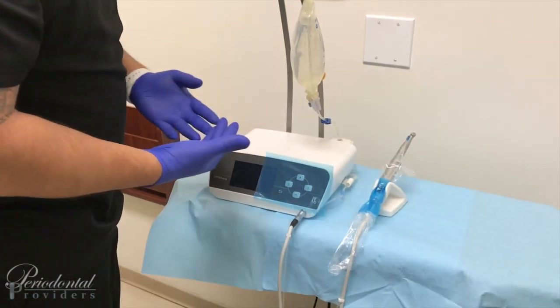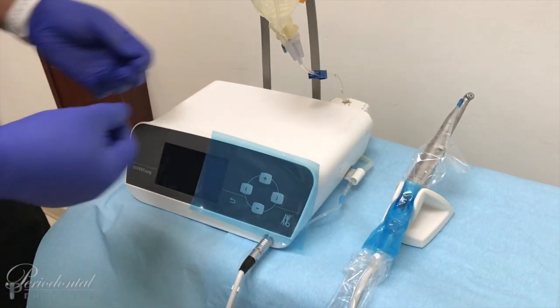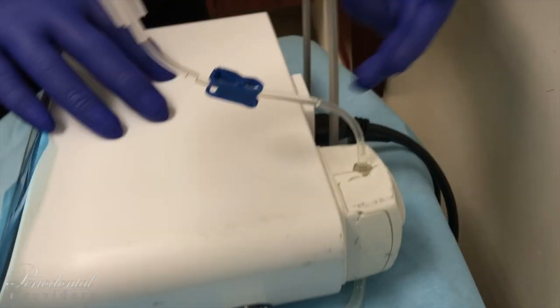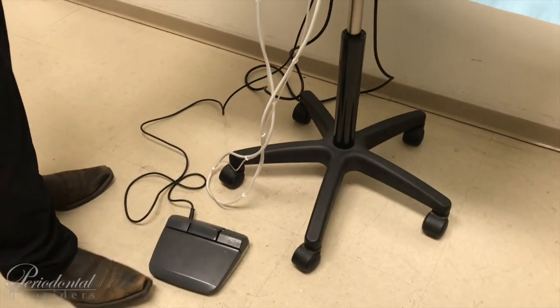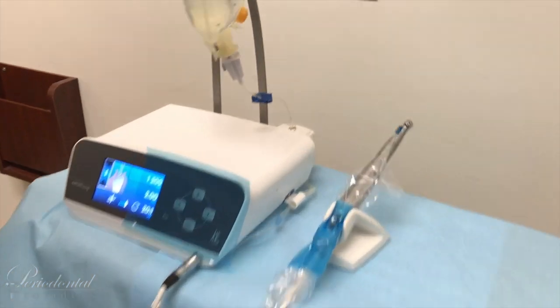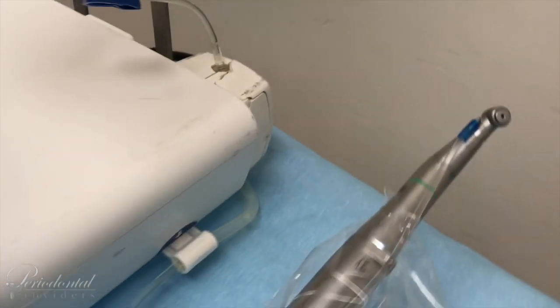Our sterile gloves are on. Now we will test the unit and make sure function-wise we are good. Before turning on the unit, open your water line by releasing the clip — now your water line is open. Come around the back side and power on. The unit is ready to go. At no point do you touch the handpiece. Test your pedal. Now run your water line — we have water. We are good to go.